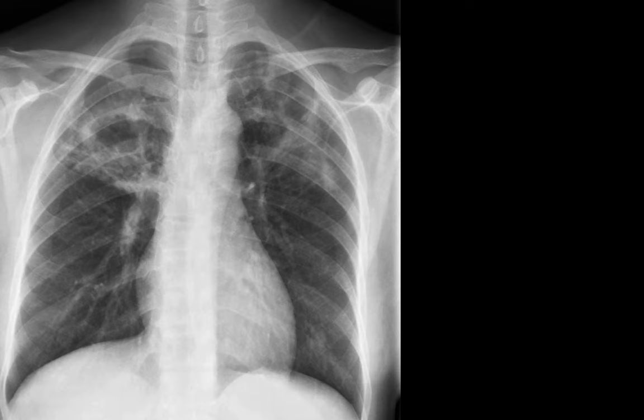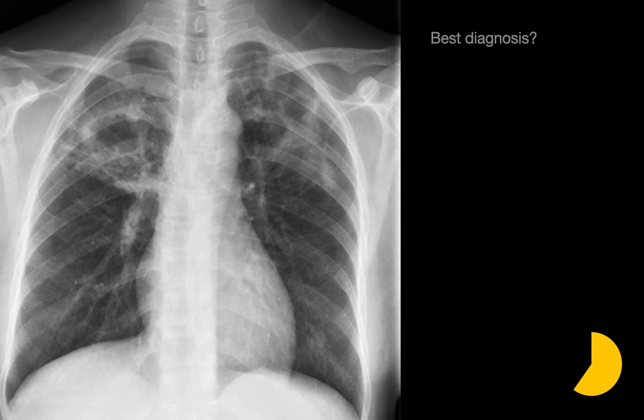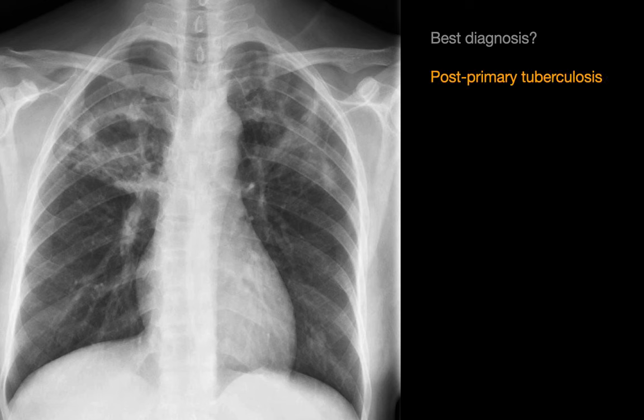These are thoracic radiology border view cases, and the topic of this group are infections. What's your best diagnosis? The best diagnosis for this case is post-primary or reactivation tuberculosis. TB mimics such as non-tubercular mycobacterial infections and endemic fungal infections can on occasion present with this reactivation TB pattern too.